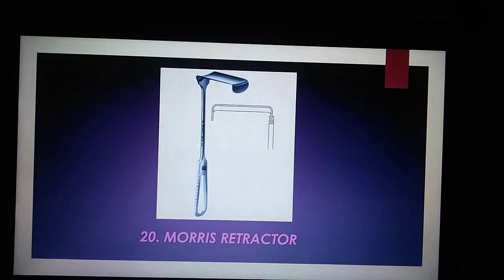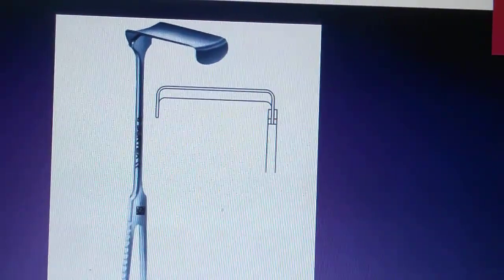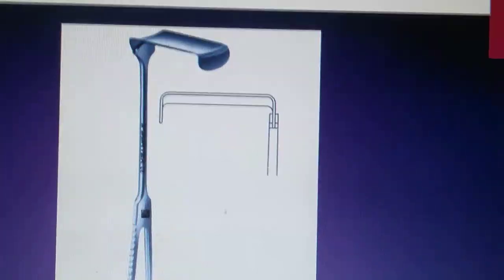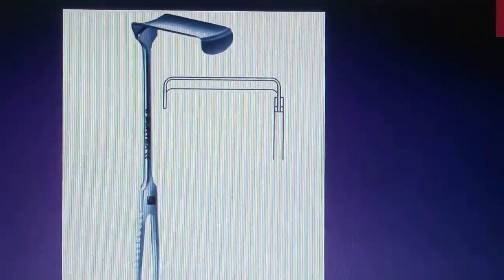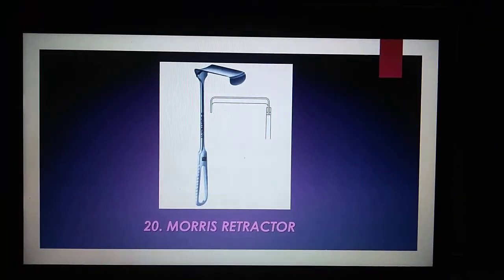The last one is the Morris Retractor, which is used to widen the incision edges or wound borders during a broad range of surgical procedures, specifically those involving the thoracoabdominal area.